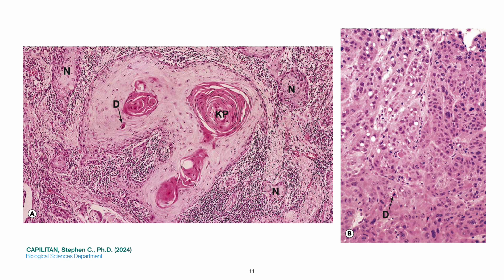The degree of differentiation varies widely. Well-differentiated tumors, as seen in letter A, have cytological features similar to the prickle cell layer of normal stratified squamous epithelium. The cells are large and slightly fusiform in shape, and the nuclei exhibit a moderate degree of pleomorphism.